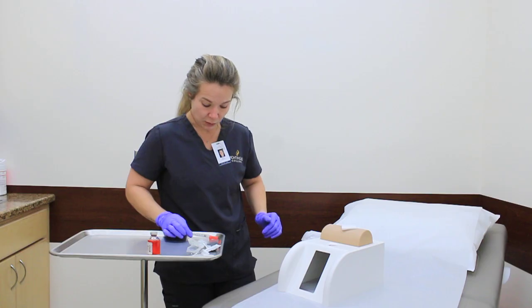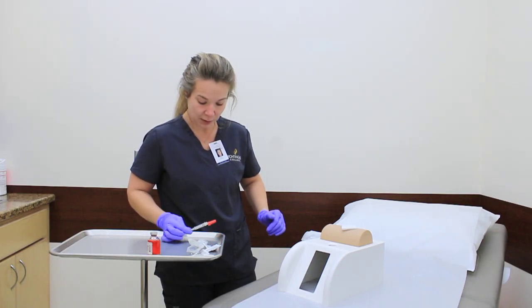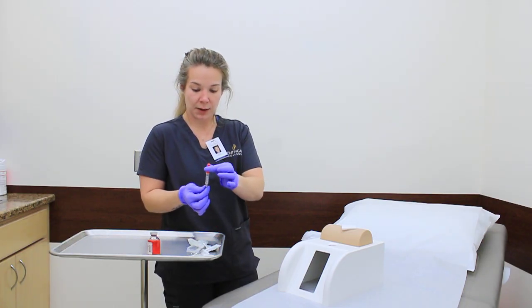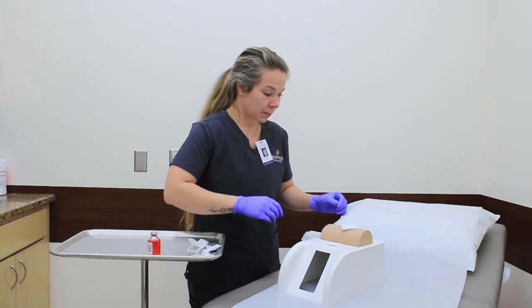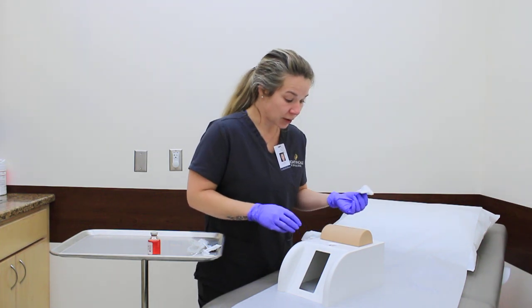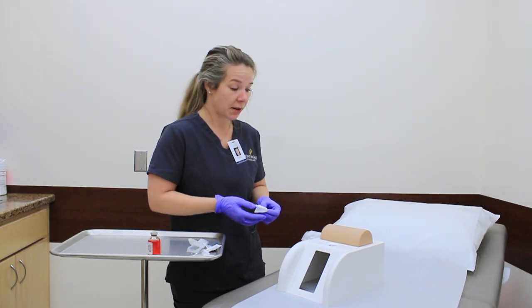I'm going to go ahead and use the one-hand scoop method to recap the needle here. And this needs to go in a sharps container. And confirm there is no bleeding, severe irritation, or anything.